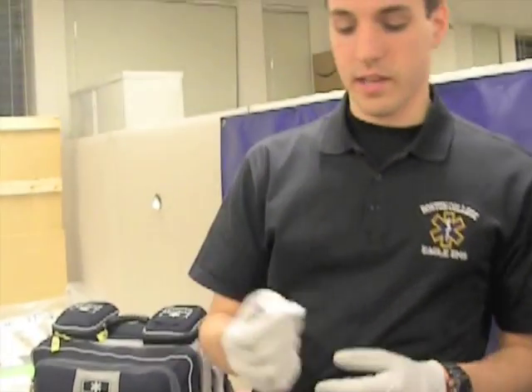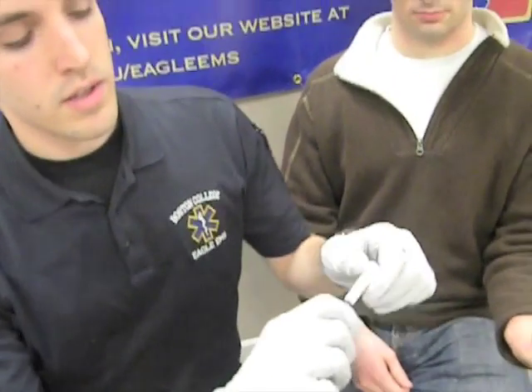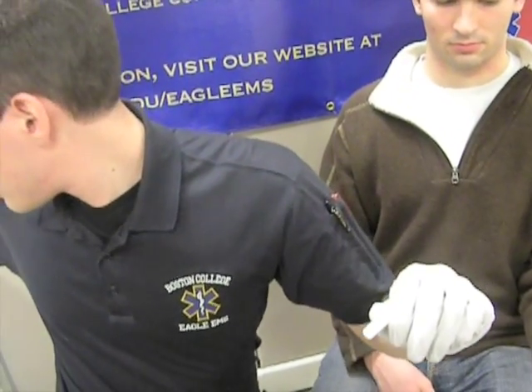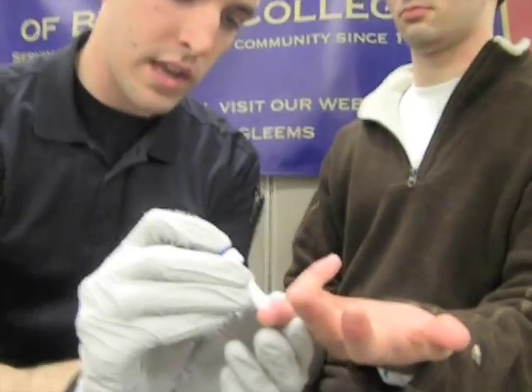And we're going to prepare our lancet. So now that we've made sure our finger is dry, we're going to get the lancet ready — twist and pull out, put it right up against the finger, and just press down.